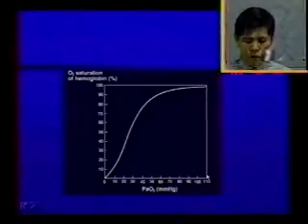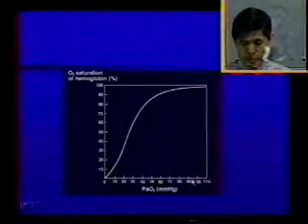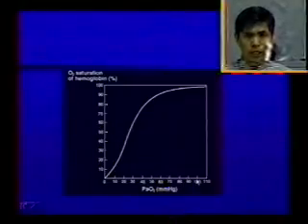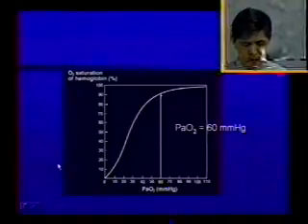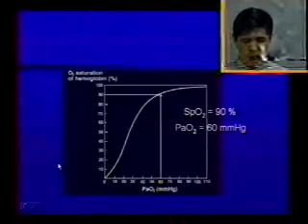And then by knowing that information, you can have an idea about the arterial oxygen tension. See, we don't want to use blood gas all the time. We don't want to stick our animal all the time and get arterial blood and come up with the arterial oxygen tension. So the pulse oximeter will give us an idea about the level of this PaO2, the arterial oxygen tension. So for example, if the arterial oxygen tension is 60, using this curve, the SpO2, the saturation of oxygen, is 90.